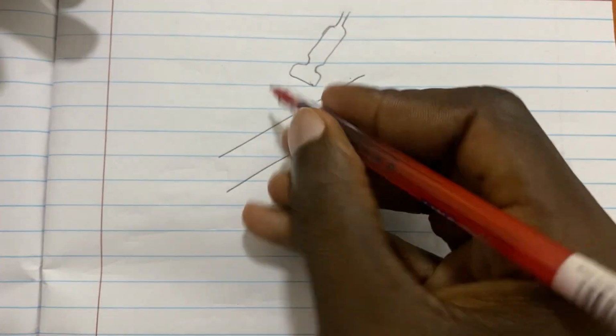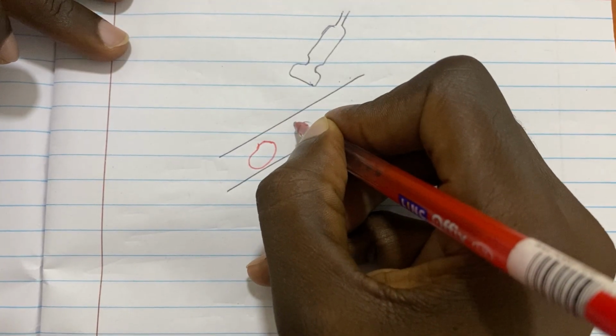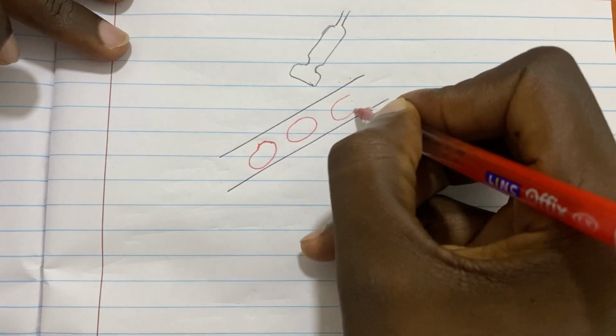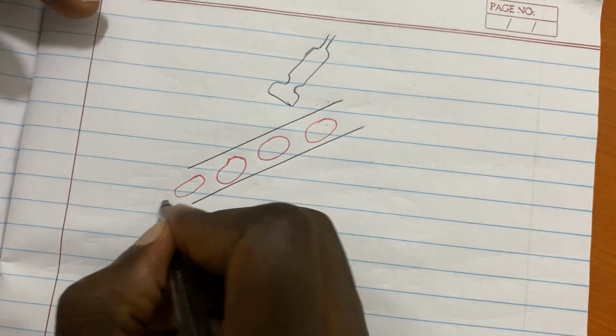This blood vessel has some red blood cells moving in this direction.